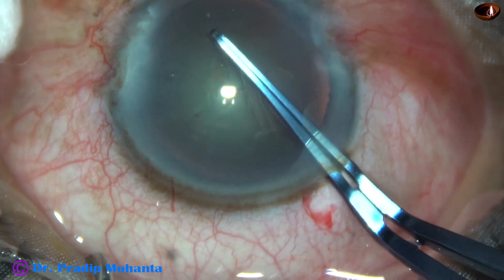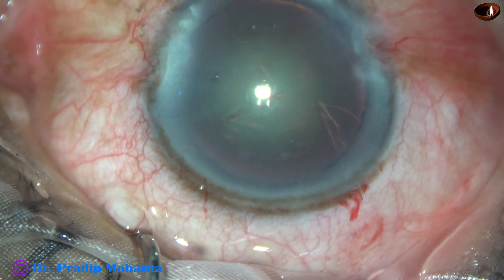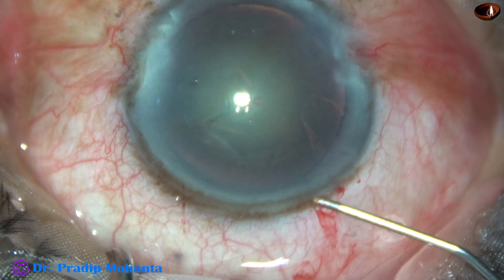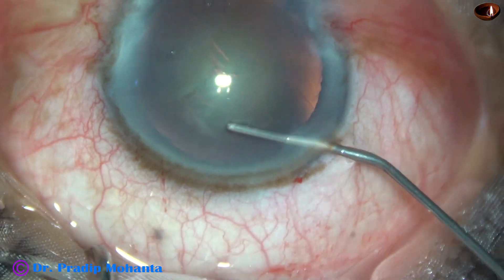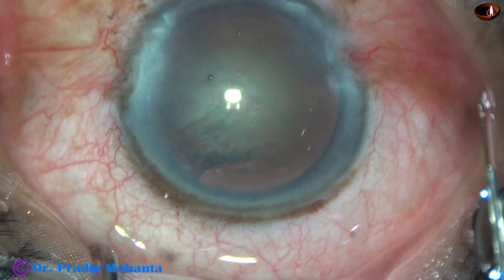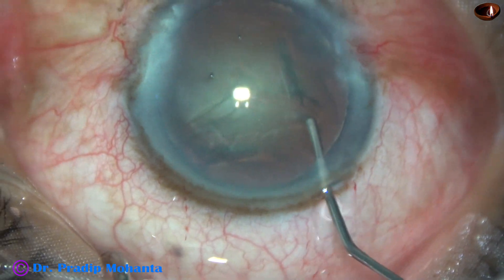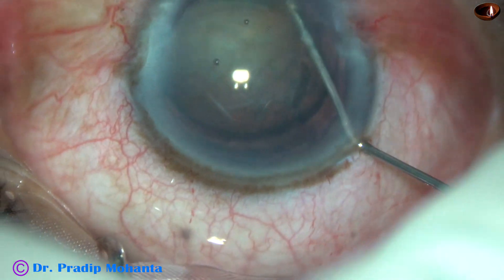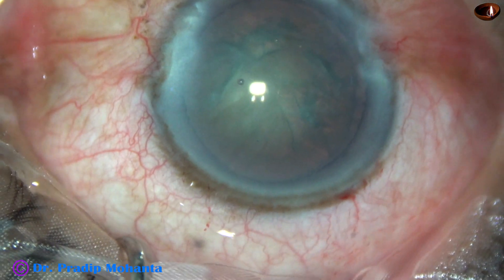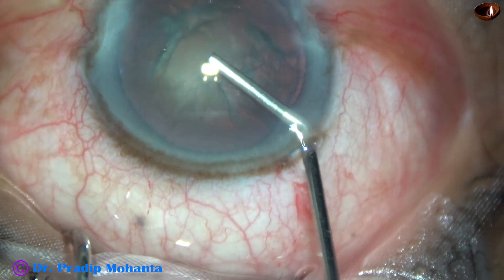And now hydrodissection. BSS is passed just under the anterior capsular rim after expressing out some amount of viscoelastic from the anterior chamber. The nucleus is depressed and then rotated.